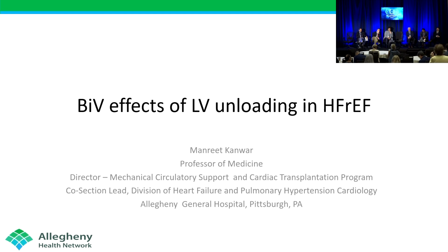Impella 5.5 would do the same to the workload, but it would not distort the septum because there is no surgical intervention with permanent changes of the geometry of the heart. So maybe these two cases give us a clue that if we are afraid of right ventricular failure, it makes more sense to keep them longer on temporary support to fix these effects of low cardiac output without permanently changing the geometry of the ventricles.